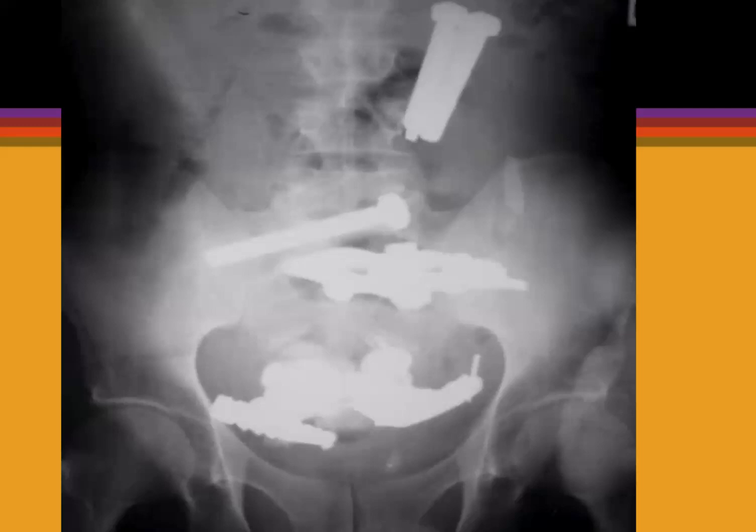It does involve a considerable amount of radiation, so should be used very carefully in younger patients. But some aspects of the abdominal X-ray are just completely replaced by CT. And actually, in trauma, CT rules really. You don't really want to waste your time getting an abdominal X-ray. You want to go straight for a CT. Anyway, happy to take questions.